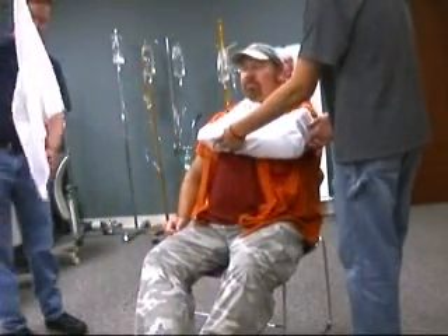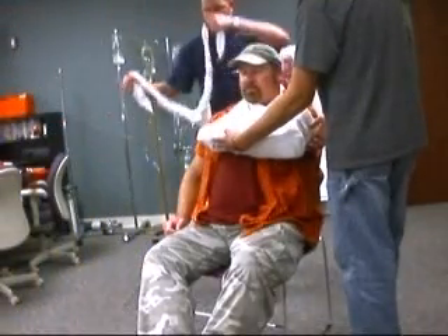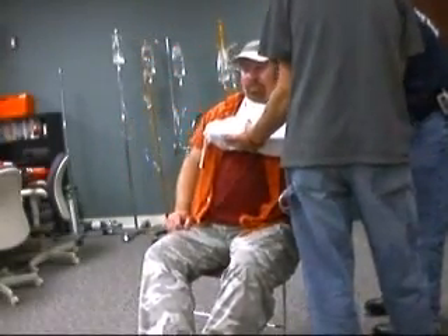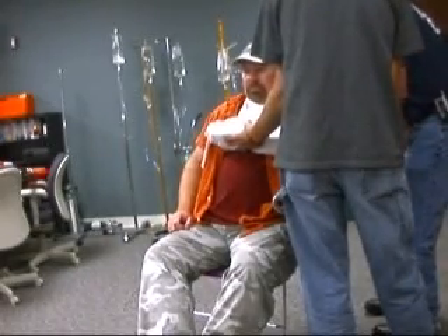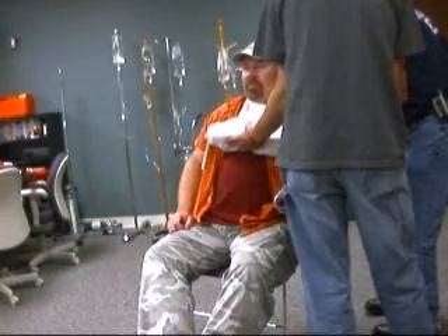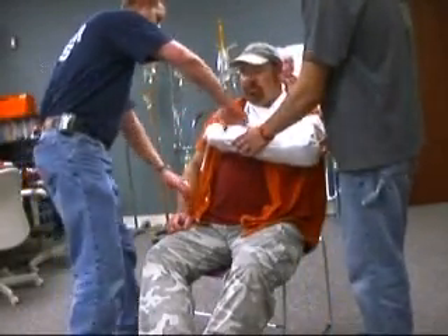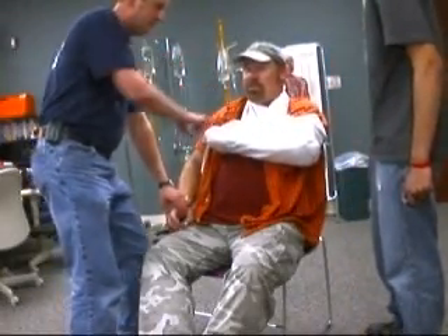Now I'm going to apply the swath, going underneath the arm. Making sure that's good and secure. I'm then going to recheck my pulses — they're present. Capillary refill present. Can you feel it? Can you move it? Yes.